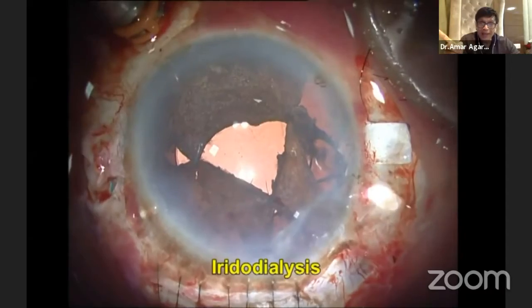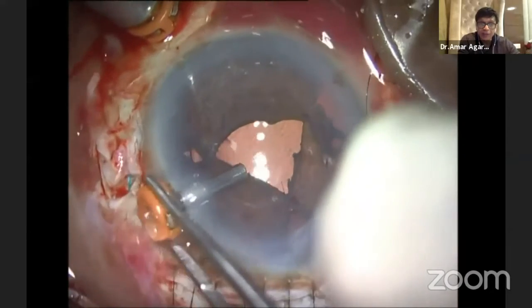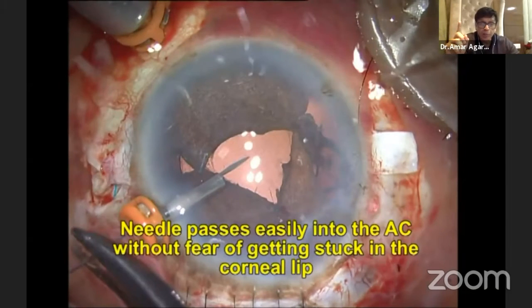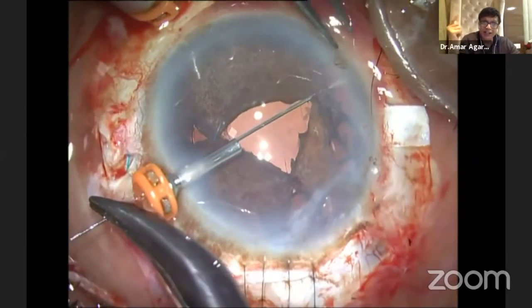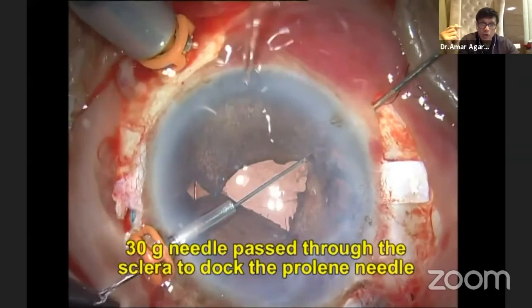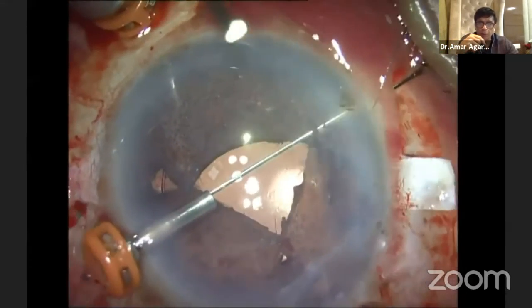Suture it and it's done. Wherever the iridodialysis is, pass your trocar exactly 180 degrees away from that. Now I'm going to take the double-arm prolene needle and pass it through the trocar — now it goes easily. One more advantage of the trocar-assisted hangback technique: if the needle is single, it moves a lot, but with the trocar it gets guided very easily. Once you have done that, I go through the iris. From the other side, I take a 30-gauge needle through the paracentesis, goes through sclera, railroad the two, bring it out. Now same thing I will be doing with the other arm of the prolene needle.